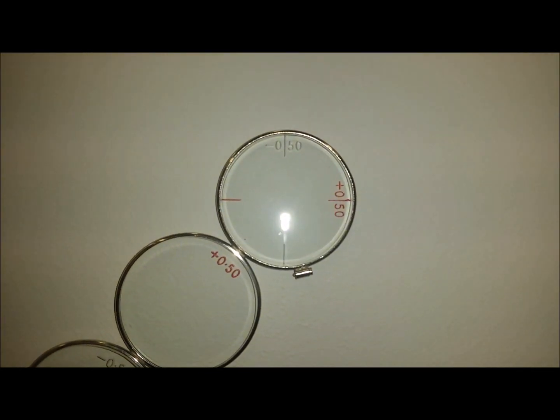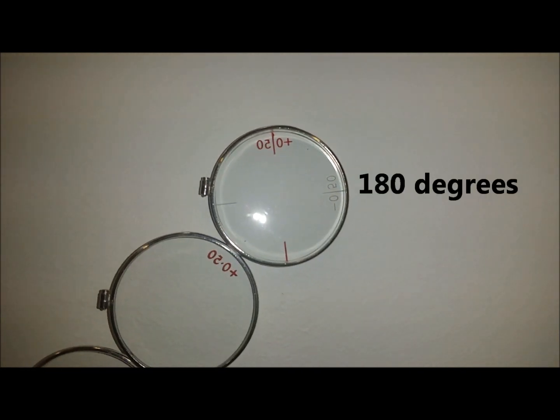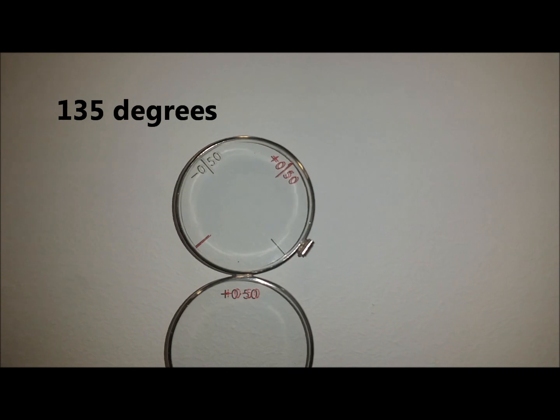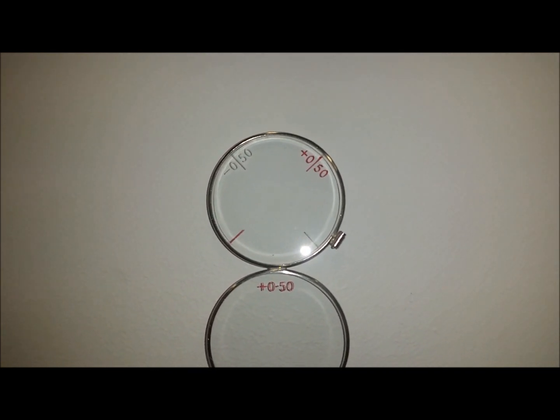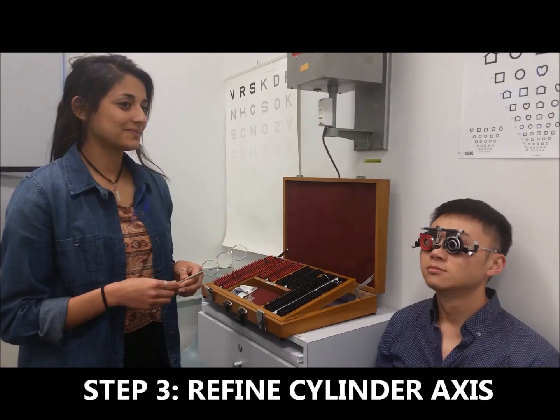In some cases, the patient may not like the lens at a 90-degree axis or at a 180-degree axis, which means we then need to check the oblique axes at 45 degrees and at 135 degrees. However, for Hongbin, our patient, this is not necessary. If they say it's better without on all axes, this means the patient does not have astigmatism.